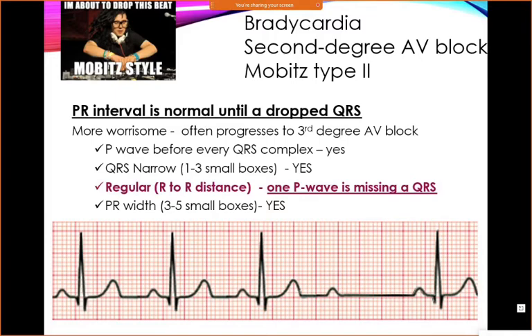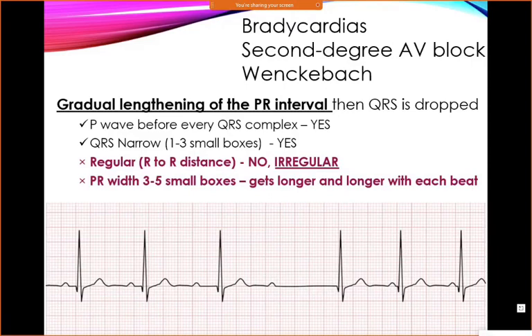There's no warning sign. All of a sudden, just a beat disappears out of nowhere. That one's a little more worrisome because that means that there's trouble with communication between the atrium and the ventricle. Here, the atrium and the ventricle are communicating. It's just that things are getting backed up. So that PR interval gets longer and longer and longer, and so we kind of expect to see the drop. So it's not that big of a deal. We'll keep an eye on it.